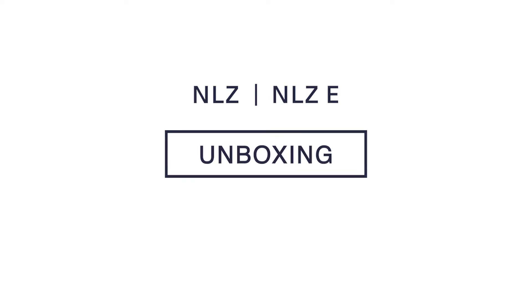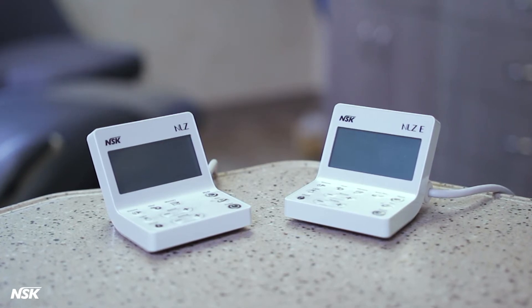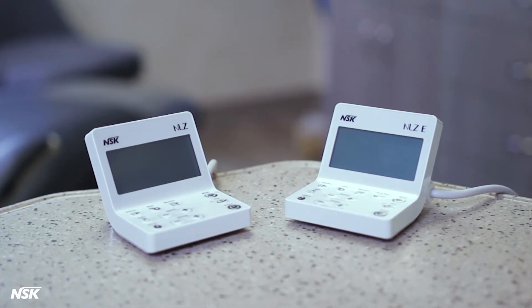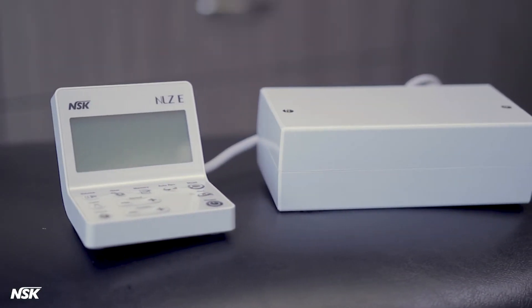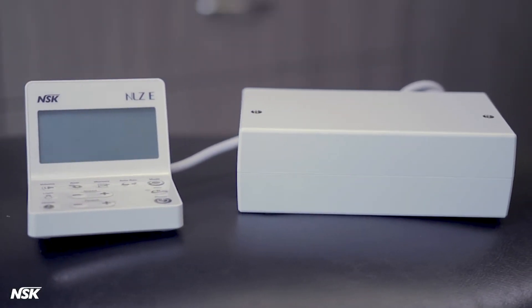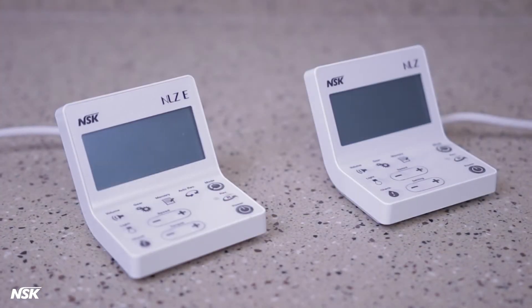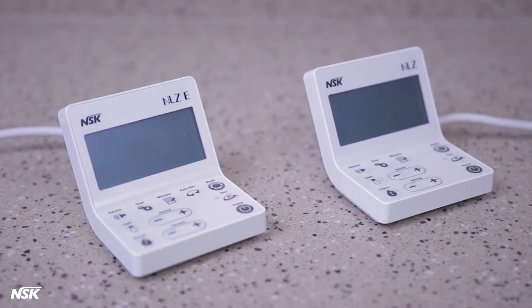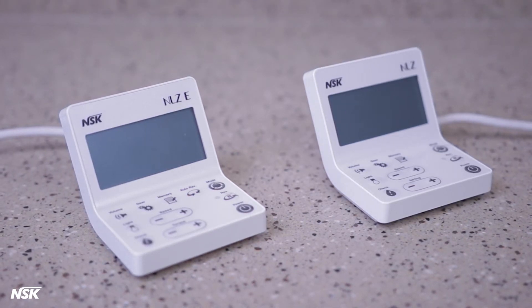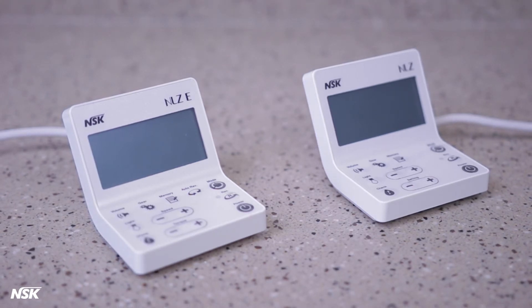The NSK NLZ and NLZ-E electric micromotor system converts air-driven handpieces to electric with LED light, and is used for restorative, prophylaxis, and endo procedures. The NLZ micromotor system comes in two different models: NLZ for general restorative, and NLZ-E for general restorative applications plus endo rotary and endo wave 1 reciprocal.